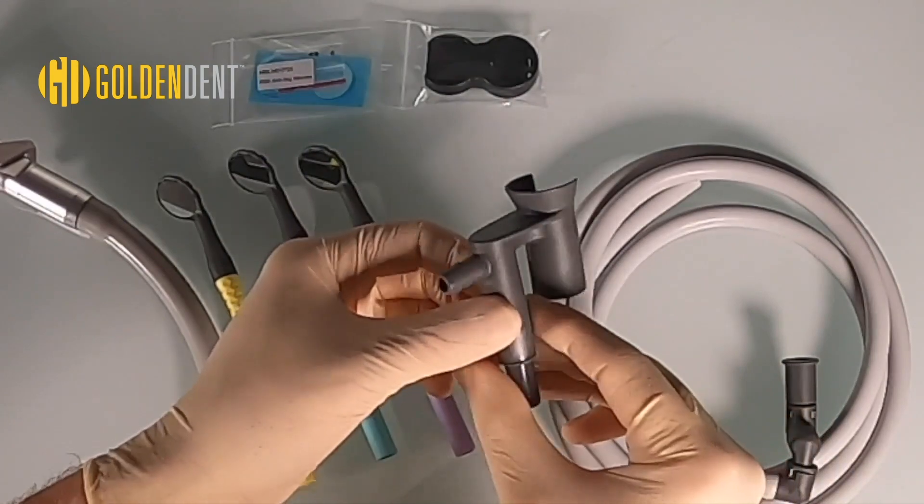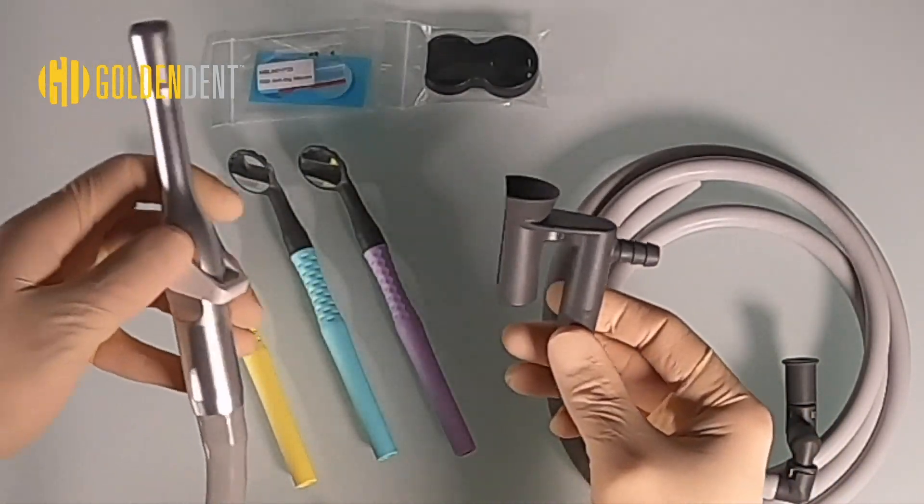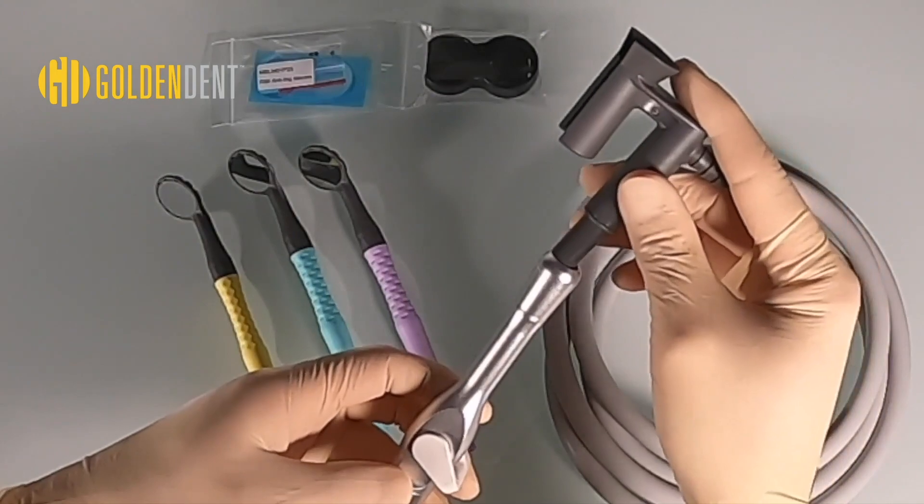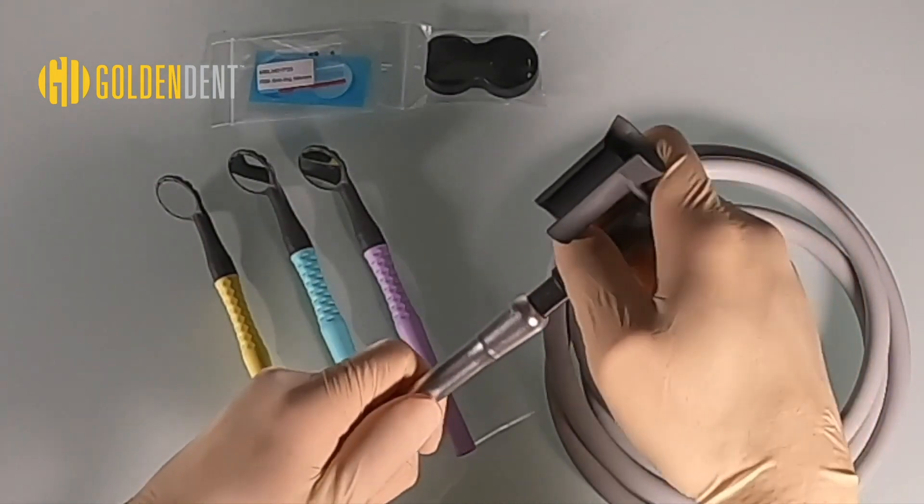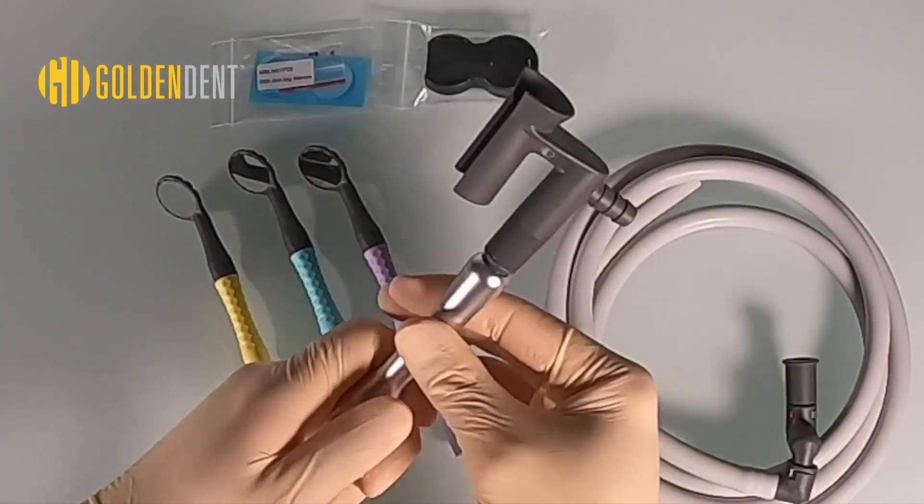This is the HVE adapter and mirror holder that slide into the top of the HVE suction. Our M7 mirror handles, tubing, and hookups are fully autoclavable.